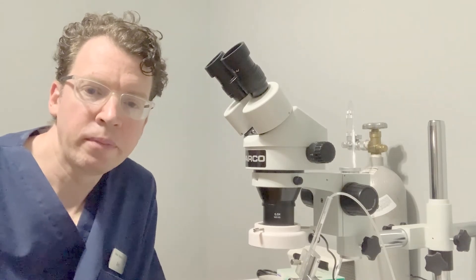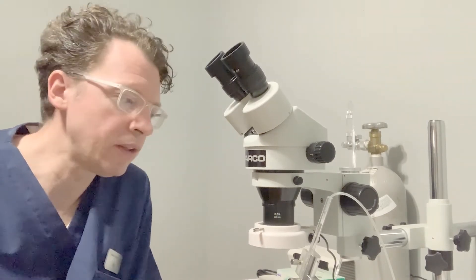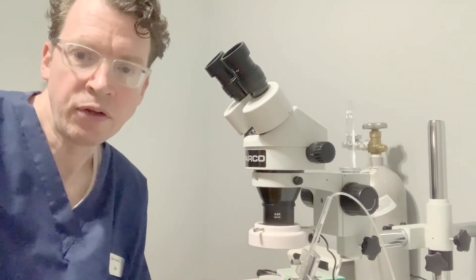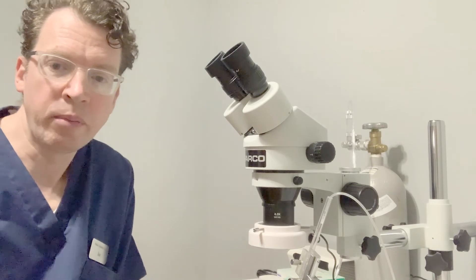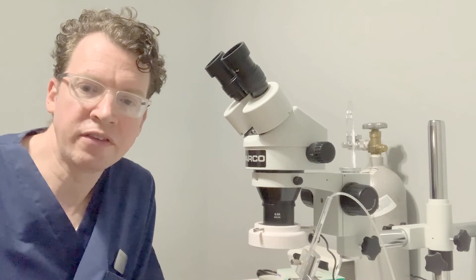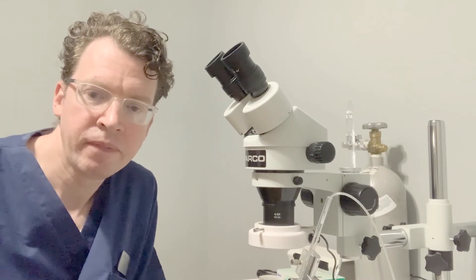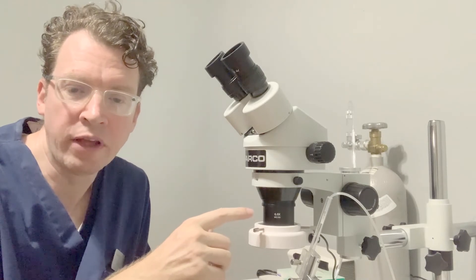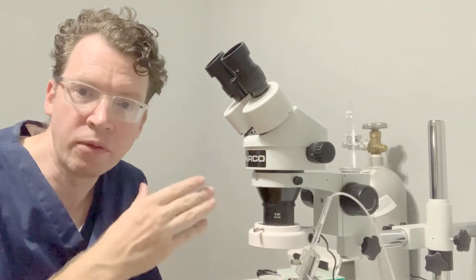Next, you will need a microscope. I chose a Parco Scientific boom microscope with an LED ring light. You will need accessory lighting to see your work area under the microscope. Make sure you use LED lighting that does not produce heat, as the queens are very sensitive to temperature. I also added a 0.5 times Barlow lens to my setup to increase the working distance under the microscope.